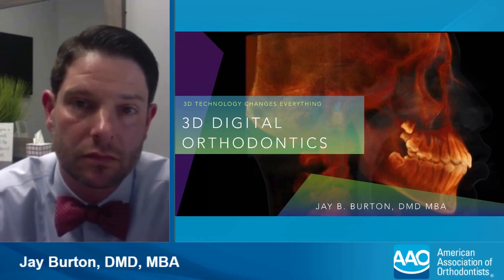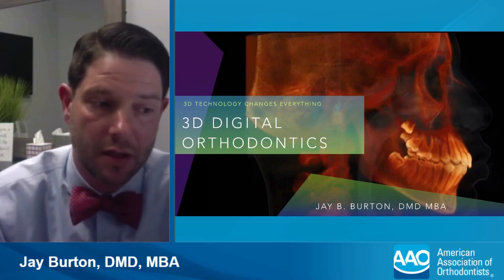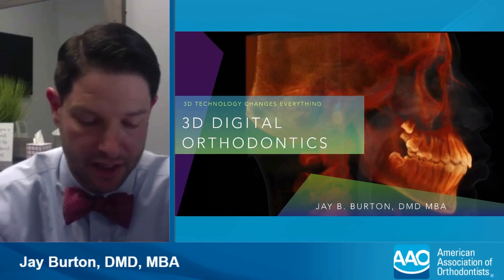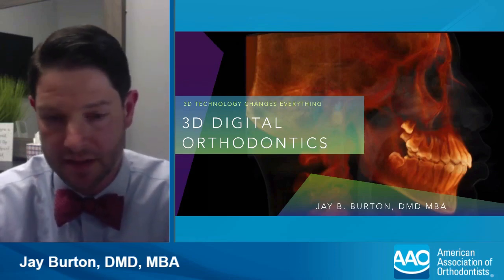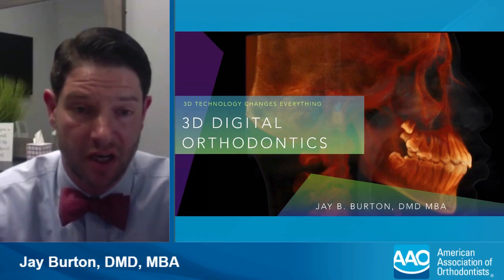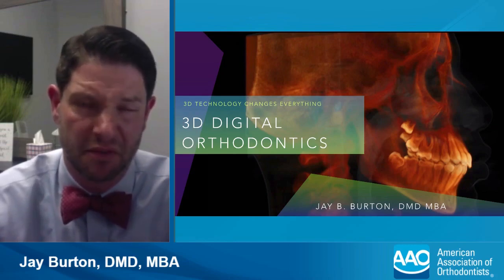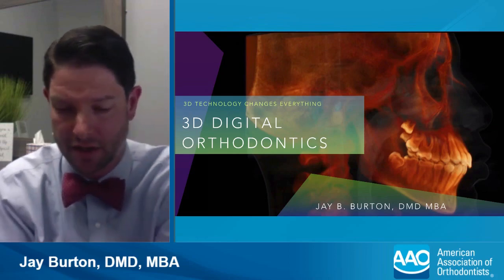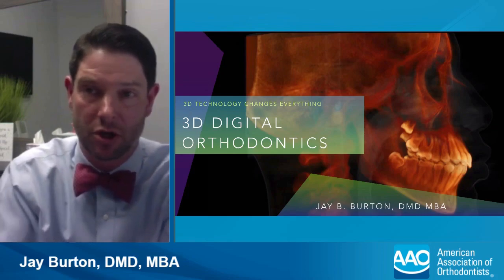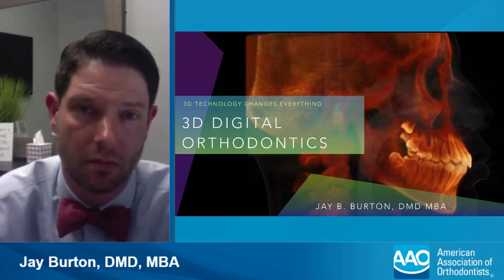All right. A couple questions about which software you're using to manipulate your images. So I use Romexis. Planmeca makes the machine that I use, the ProMax Mid, and Romexis is their imaging package that comes along with that. So there really isn't any additional software. I think they actually upgrade the version that you're on for free, if they're at a 4.5 to 4.6 to 4.8, those upgrades are all free. And then it's just a minimal charge when you upgrade to like 5 or like 6. So I just use Romexis.